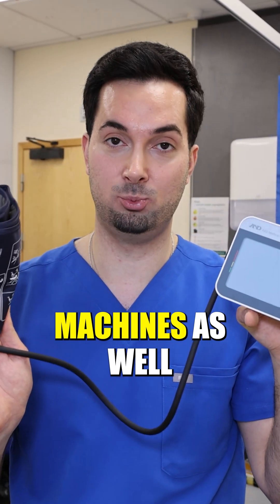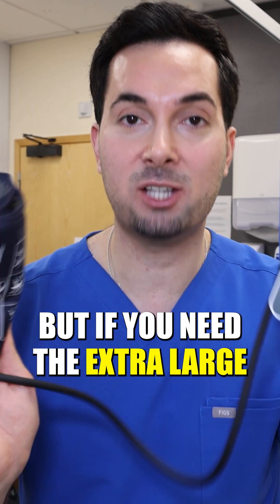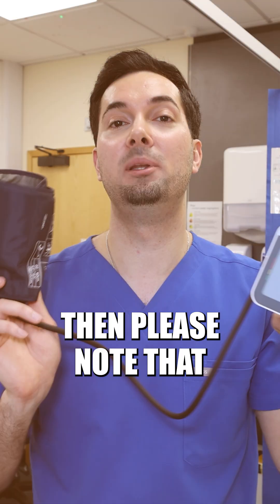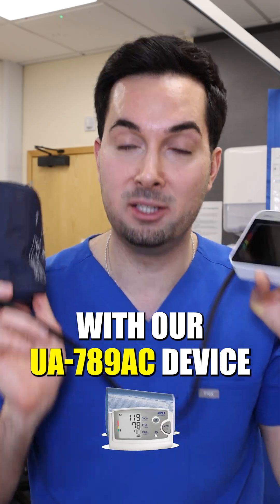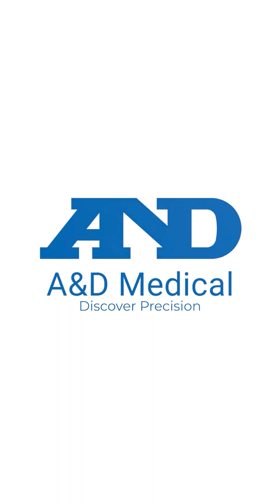It's also worth mentioning we have the small and large adult cuffs, which will fit our other machines as well. But if you need the extra large blood pressure cuff, please note that cuff is only compatible with our UA789 AC device, the A&D Medical Discover Precision.